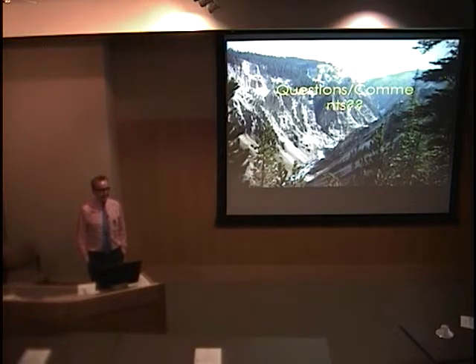What's the range of adjustment capability on this? On the light adjustable lens? Yeah. In vitro studies show about 4 diopters. I think we've asked Calhoun this question ourselves. It's about 2.5 to 3 diopters on average.